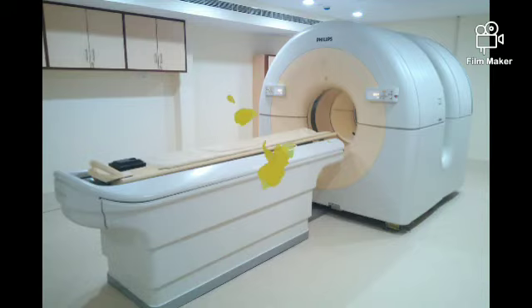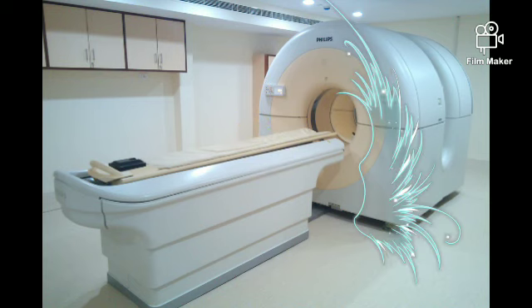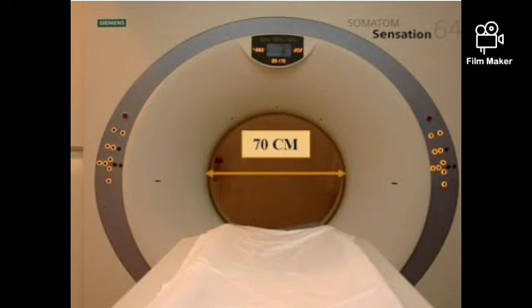And this is today's modern CT scan machine, and this is not only a CT scan, this is a fusion machine known as a CT PET machine. Wow, we are now in the modern era. So looking forward, we are moving to the main equipment for the day.